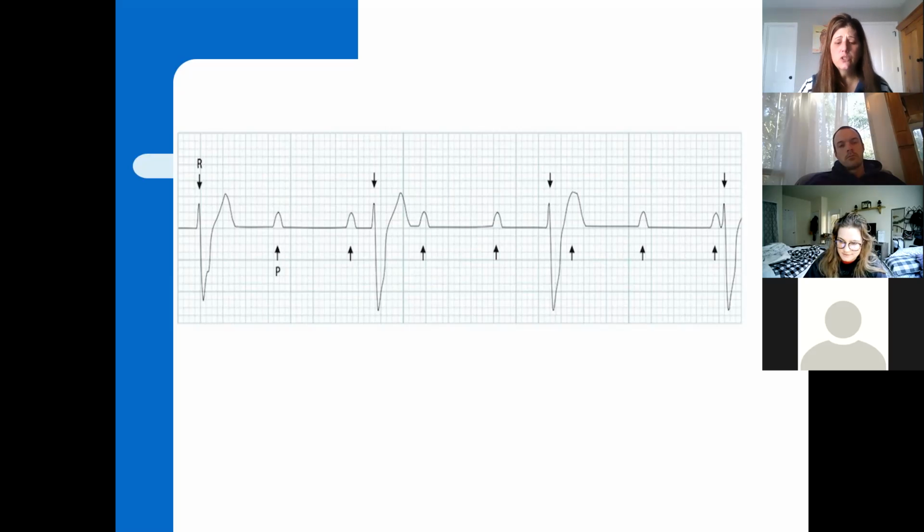I will tell you too, when you start doing your basic EKG test that opens up later today, and your weekly EKG, math EKG sheets, there are some of them we understand they're a little more grainy. They're not as clear as we would like for them to be, but you're still going to be able to easily identify what they are. Don't let that stress you out. On the test, they will be very clear. You will not have any issue.